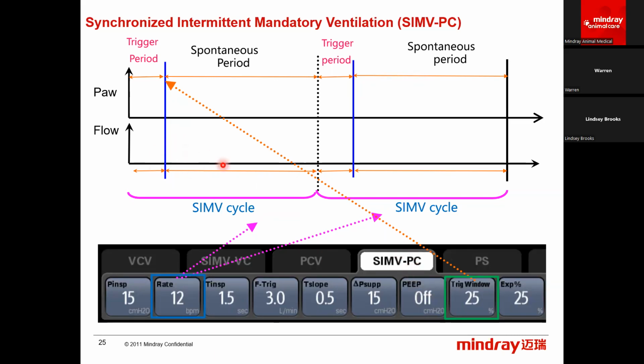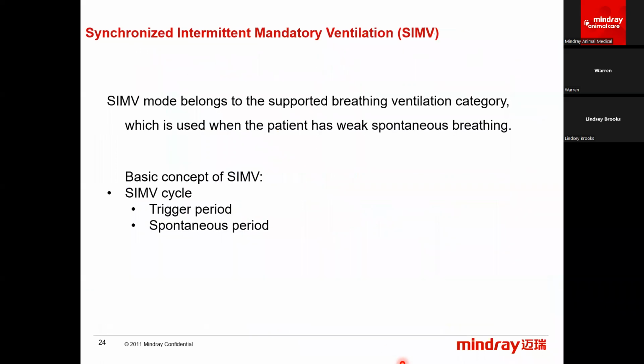It's still going to deliver all of those mandatory breaths at that set rate. But if somebody takes a breath outside of those mandatory breaths, we're going to support those breaths. And that's why it's good for your patients with weak spontaneous breathing.